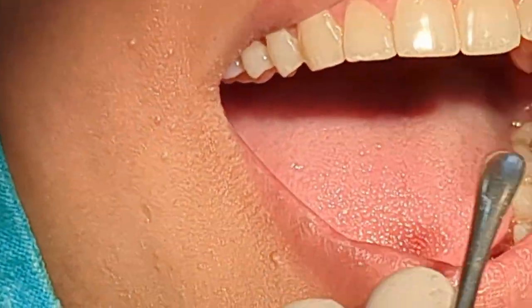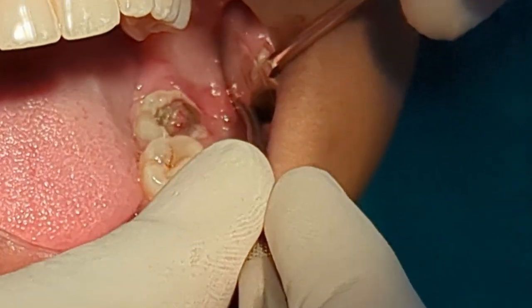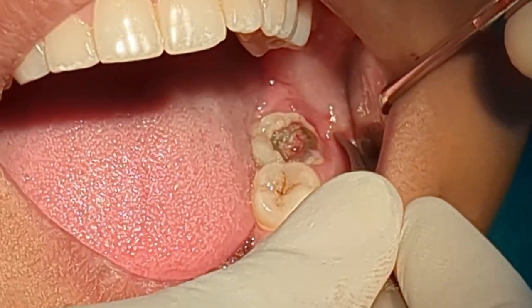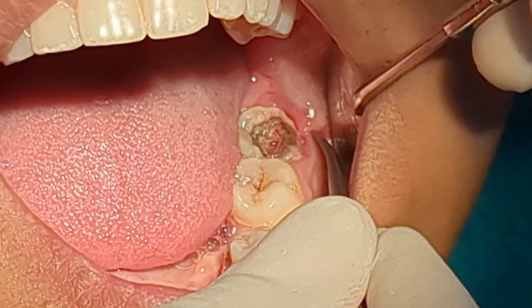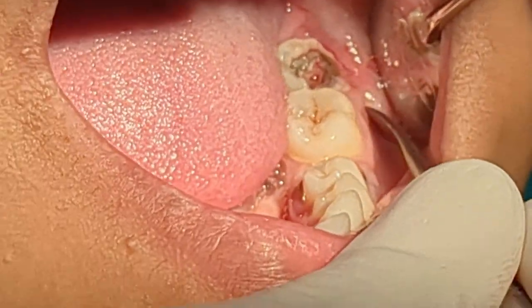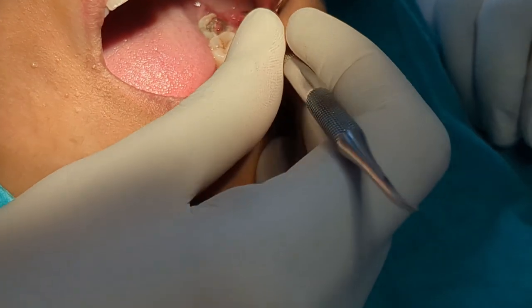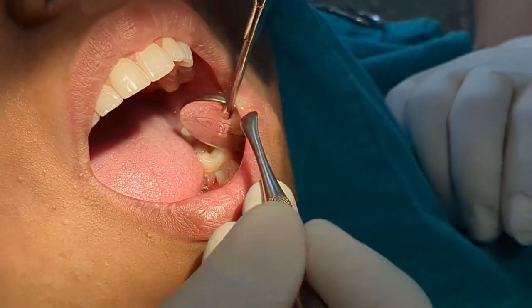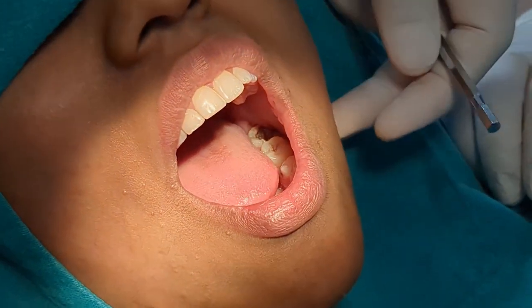The patient has reacted to the pain on that side. Now when I do the same on the side where I have given the LA, even if I press it a little hard, the patient doesn't experience any pain. The long buccal block has acted fine. So the patient can compare the right and left side.